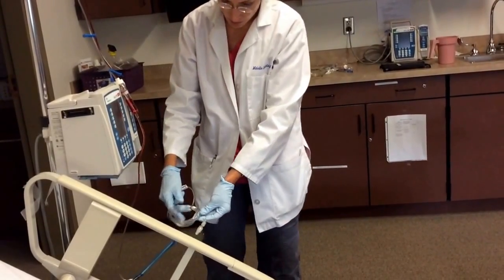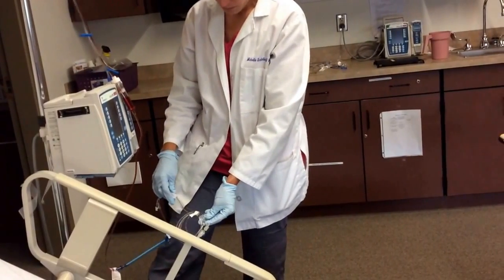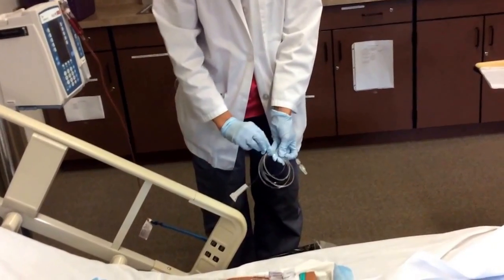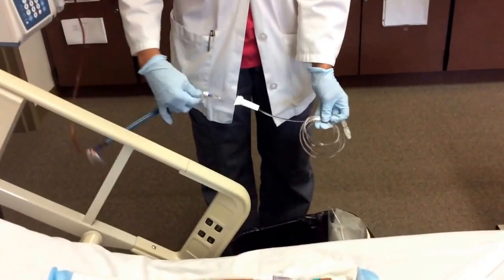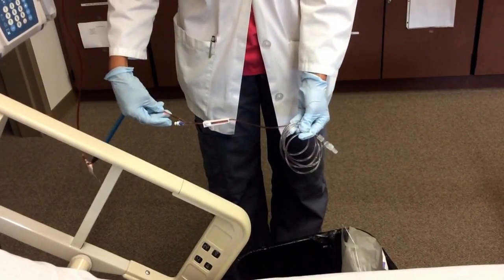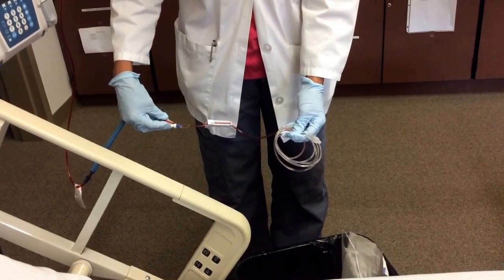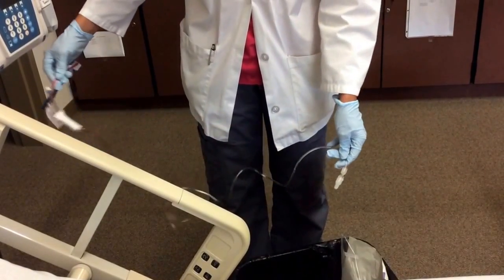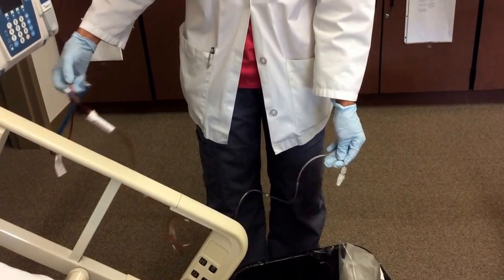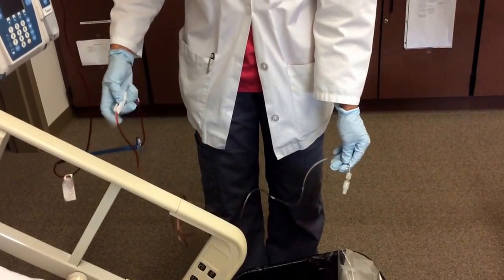Okay, I don't want to lose any of the red blood cells, but I do need to prime this down to the hub. And Mr. Smith's lung fields were clear bilaterally on auscultation. His vital signs are also within normal limits. His temperature at this point was 98.8.